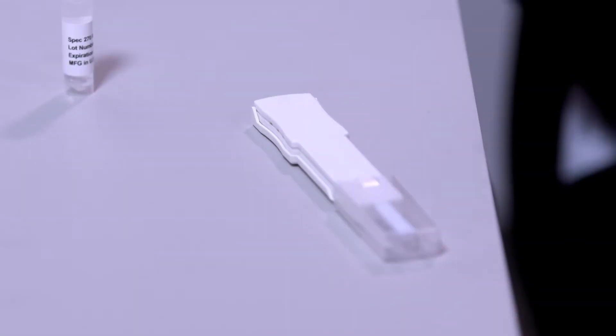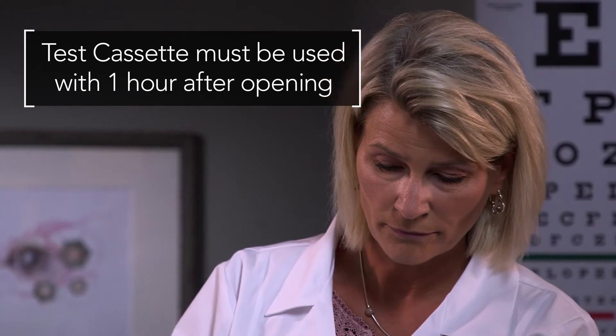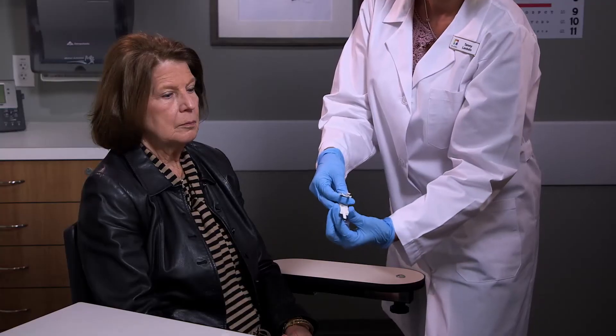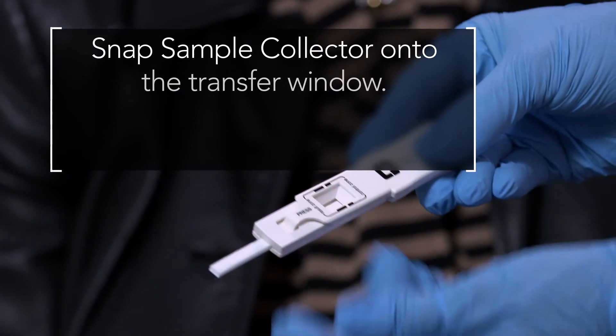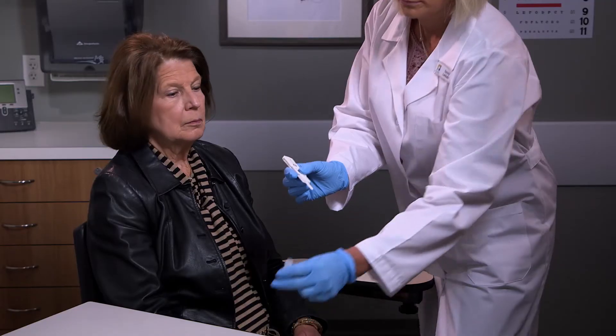Next, take the test cassette and remove the protective cap. The opened test cassette should be used within one hour. Snap the sample collector onto the transfer window, pressing firmly where indicated. The double click means the test has been properly assembled.